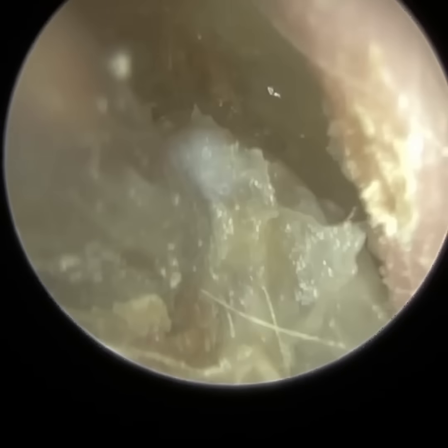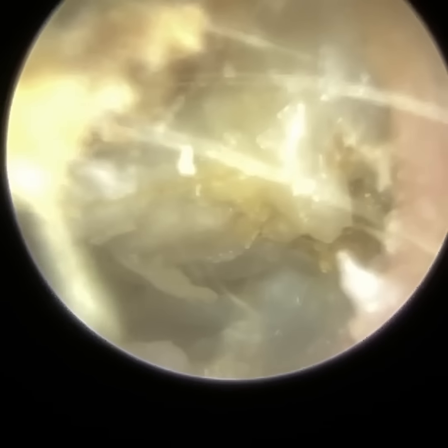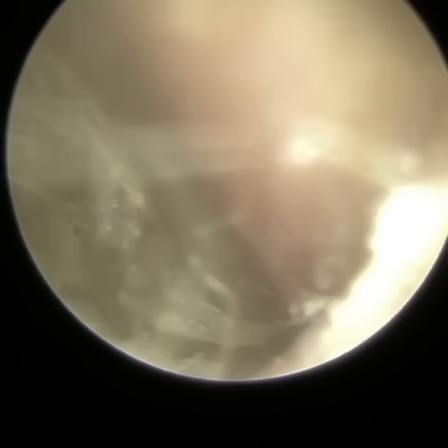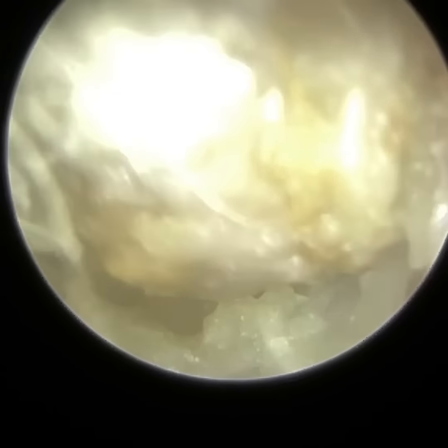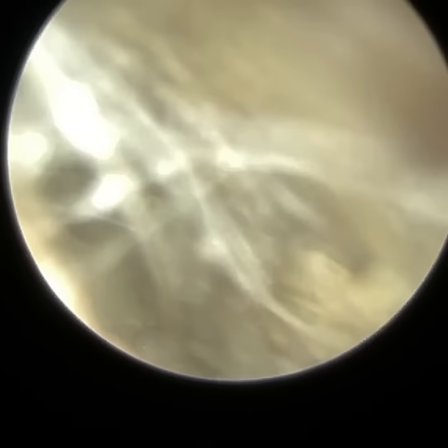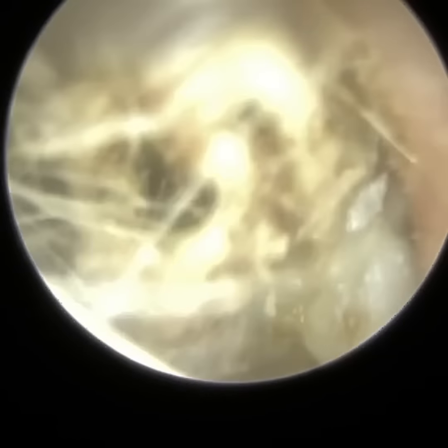You can see the patient's dry and cracked skin on the right-hand side. That's the second bend of the ear canal. I was just having a look, and the last time I saw this patient was only 4 months ago, so it is quite a severe build-up in that short space of time. Prior to that, it was 6 or 7 months, sorry. Prior to that, it was 5 months. So you can see this is a cycle, and we've referred the patient to the GP. They've seen the ENT, and it's just a case of managing this.